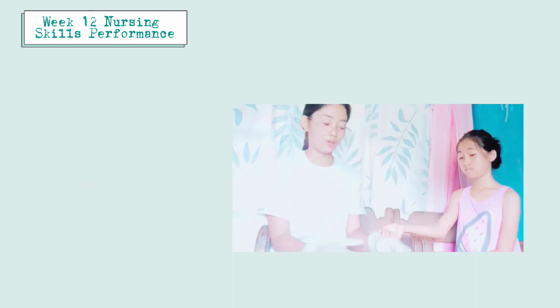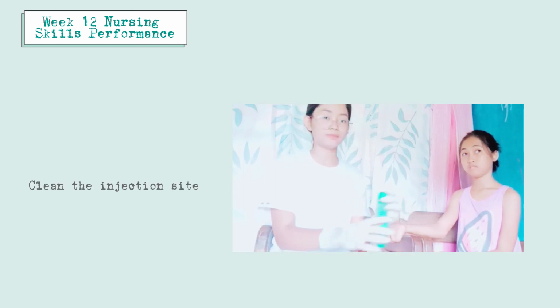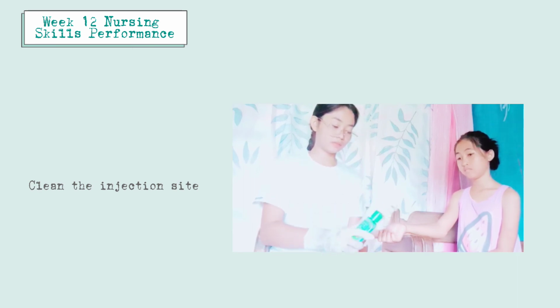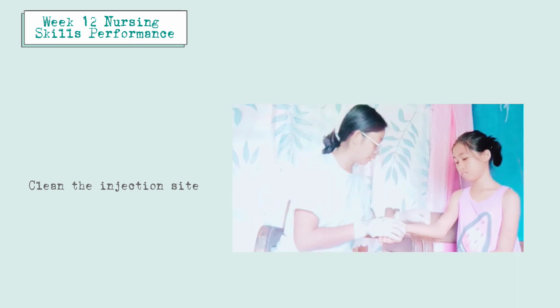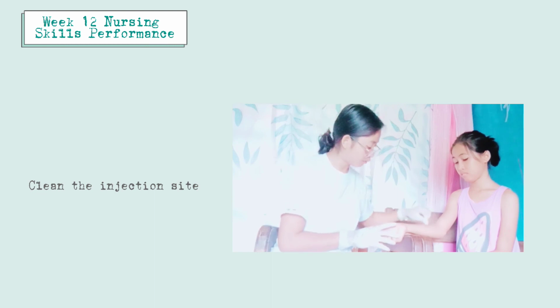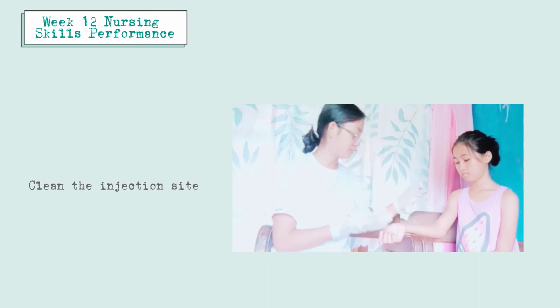Allow me to clean your arm first. Then slowly rub it. Create friction from inward to outward to prevent contamination. Rub it for at least 30 seconds. Then allow it to dry.